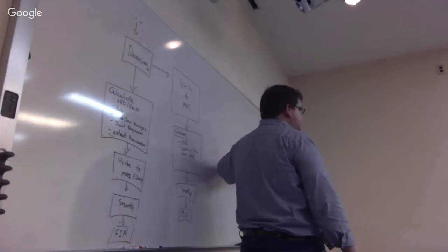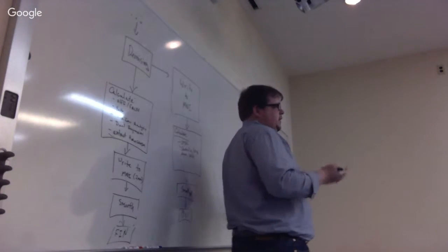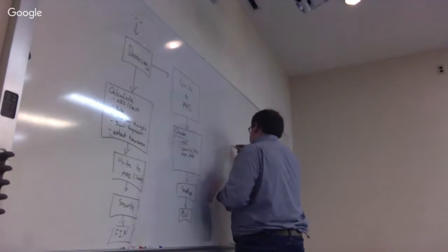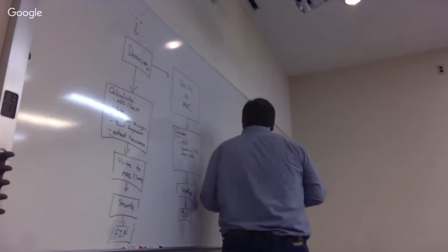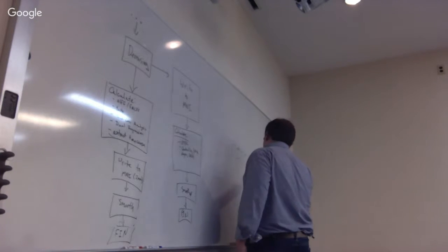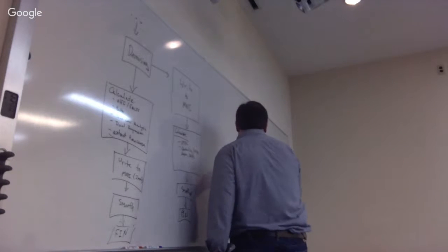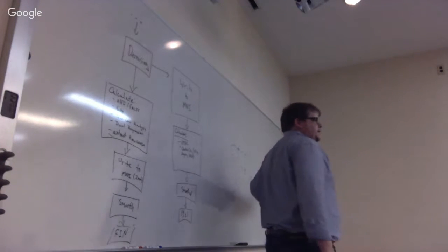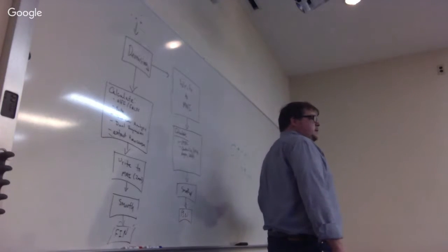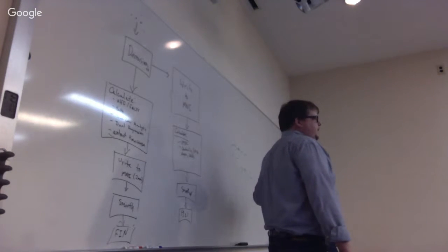Exactly, right? And then there's the smoothing from the MRI. But maybe before the smoothing from the MRI, you have the smoothing from actual head motion, and then the smoothing from the MRI, right? But the point is, if you make this here 6 millimeters, and we don't really necessarily know this one, the result is going to be probably bigger than 6 millimeters, right? And the result's probably going to vary across individuals, because the amount of head motion affects this, and that's going to be different across individuals.